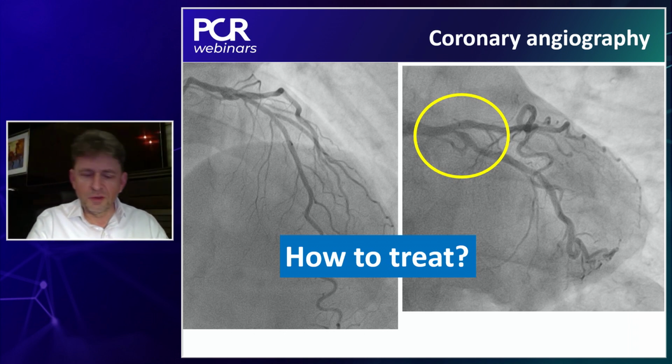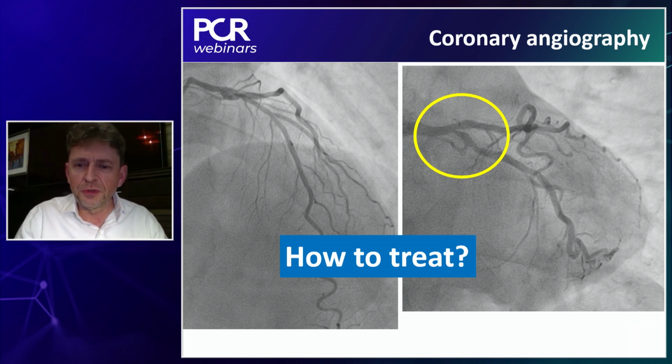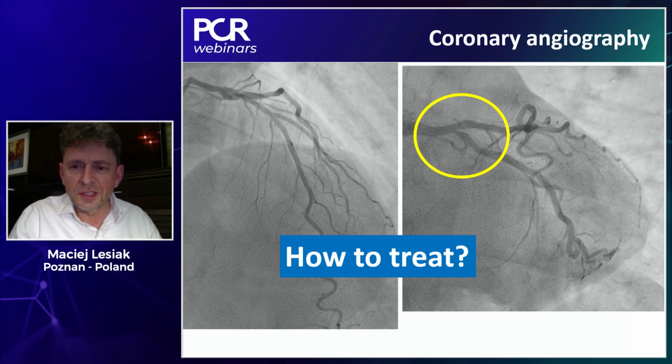Yeah, of course. This is the ugly lesion nobody likes, because left main and LAD look pretty normal, and the angulation is a narrow angle, so we can all expect that there would be some pinching of the LAD, which nobody likes. On the other hand, using a two-stent strategy is also not good, because we will cover a lot of tissue and vessels with metal unnecessarily. So I think this is always a big question.